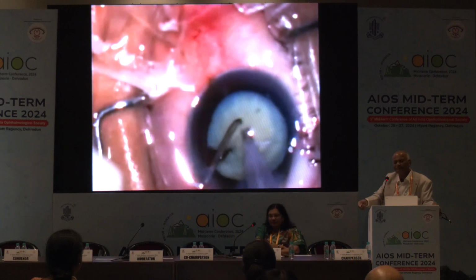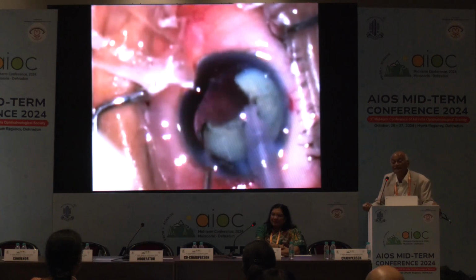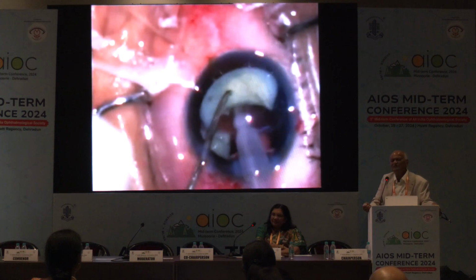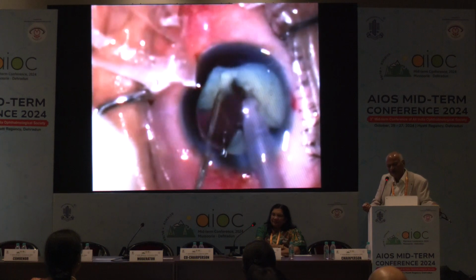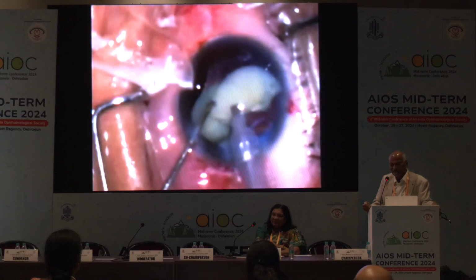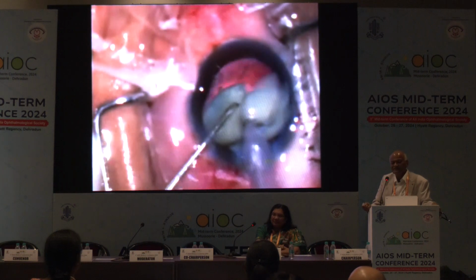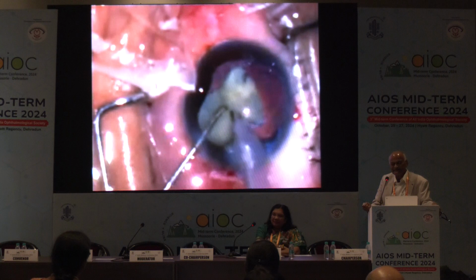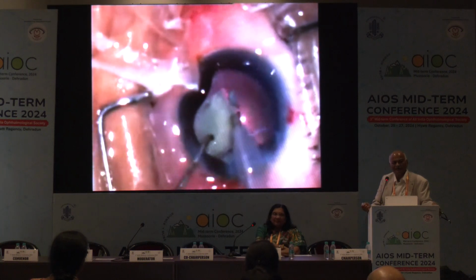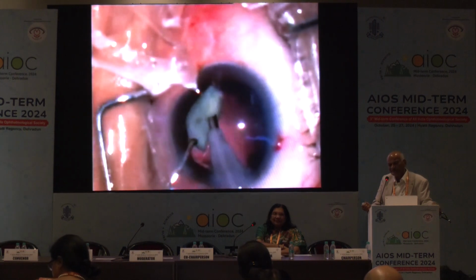Now see, same person, but how the machine is going in? It is the stroke length of the machine. Whenever you are purchasing, even a small company's machine, you must know the stroke length is good, and then you should purchase it. Here again you will see the stroke length, and the same nucleus is emulsified by the other machine, after so many problems with the first. See here, again I am emulsifying it.